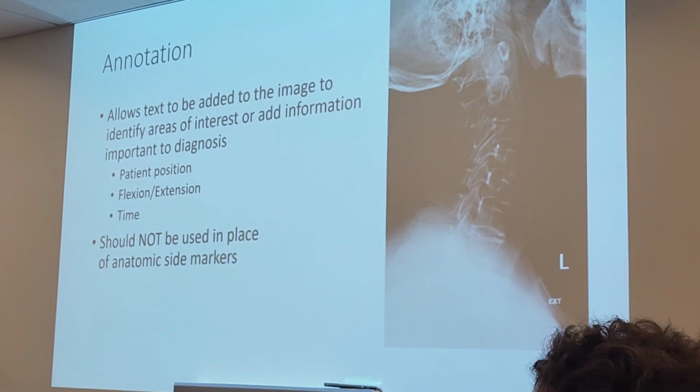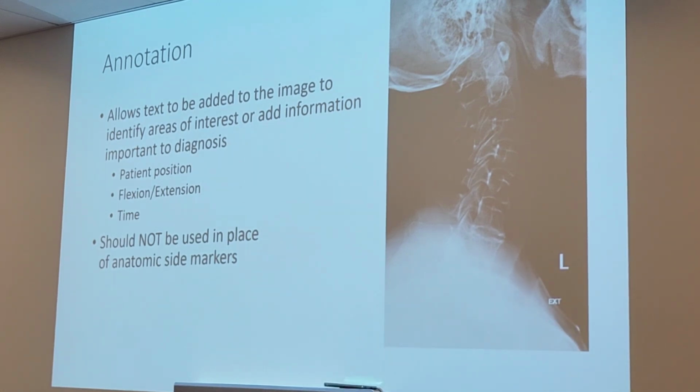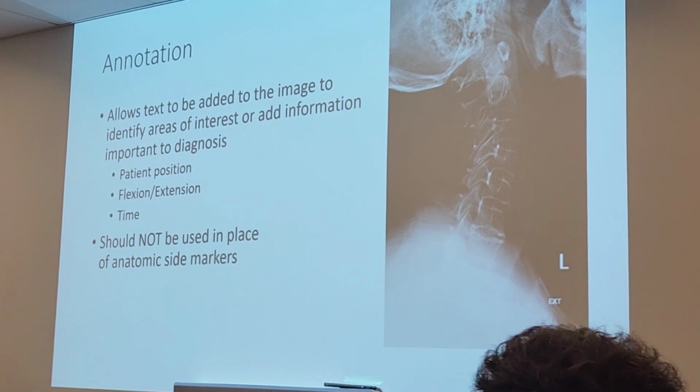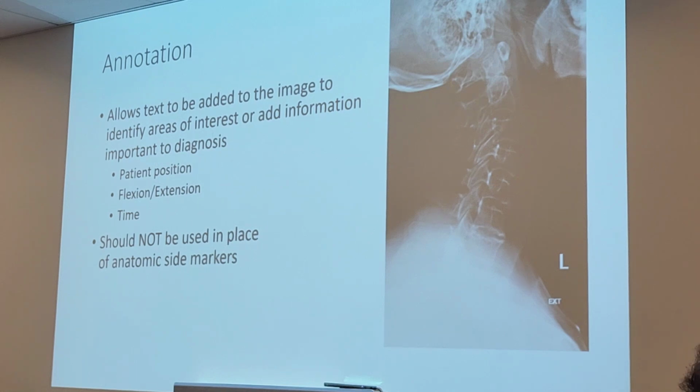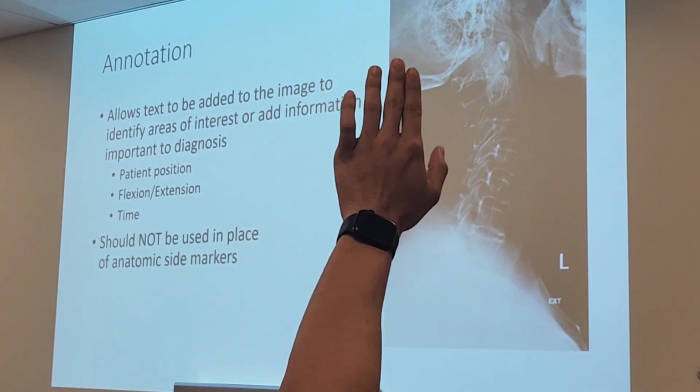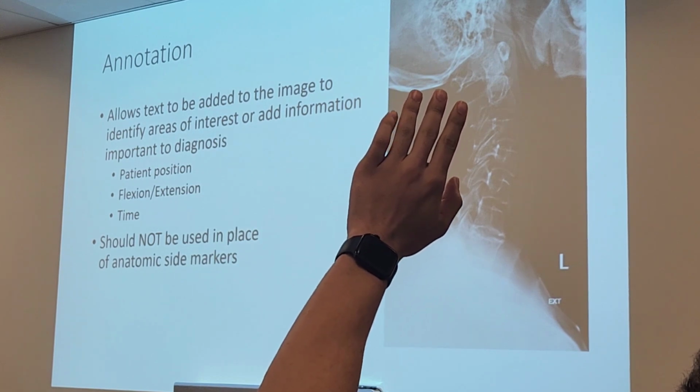So, what's the purpose of digital annotation if you can't use it to mark your images? No, you can't. The image is a legal document. You cannot use it to replace your physical marker on images.